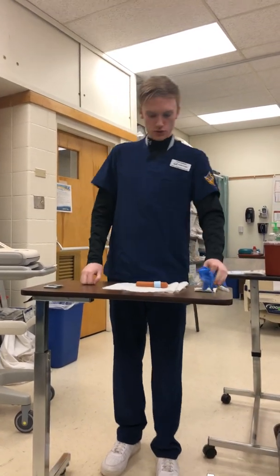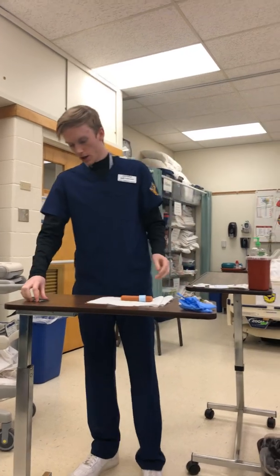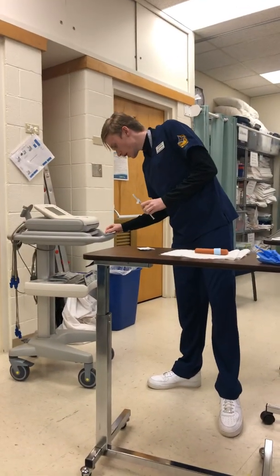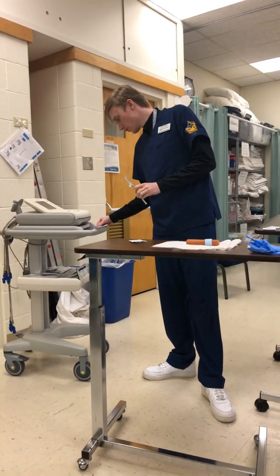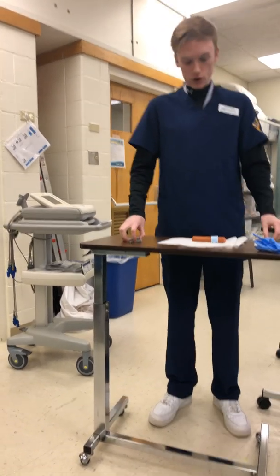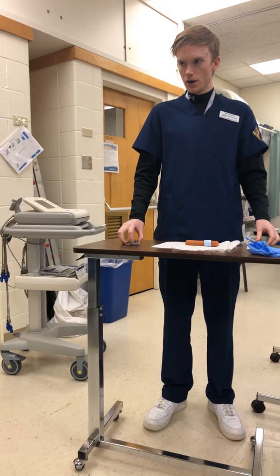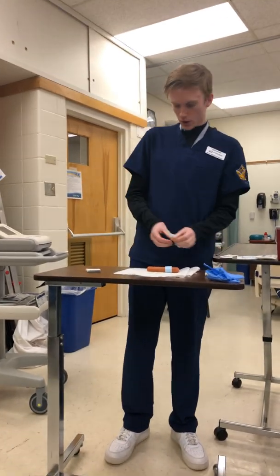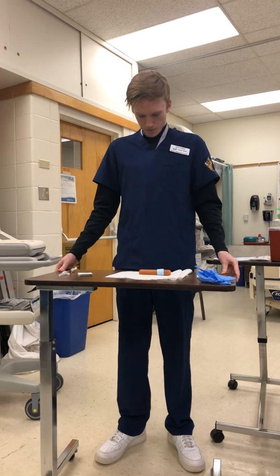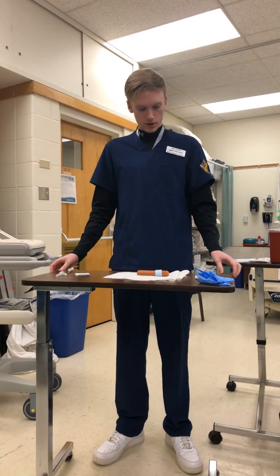So, coming to the patient's room. Hello. Hello, my name is Nurse Downing. I will be here to give you a Rocepin 1 gram intramuscular injection. We're going to do it with the Z-track method. Are you familiar with this procedure? Yes. Wonderful. So before we start, could you give me your full name and date of birth? Frank F. Berter, 3/14/50. Perfect.